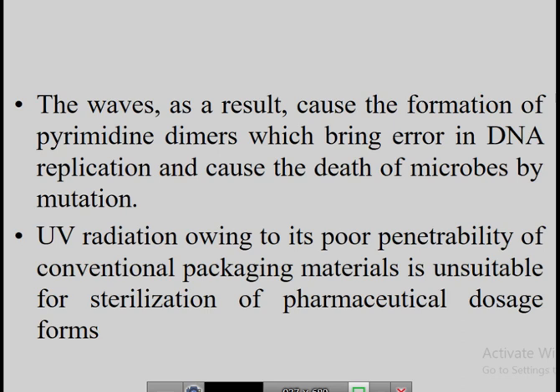The most disadvantageous thing about UV radiations is their very poor penetration. So formation of thymine dimers, which results in death of the microorganisms, is the ultimate effect of exposure of microbes to UV light.